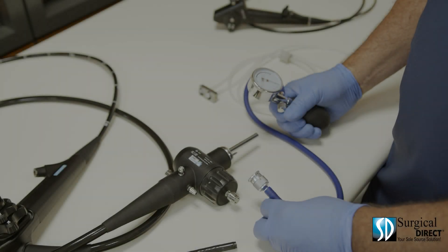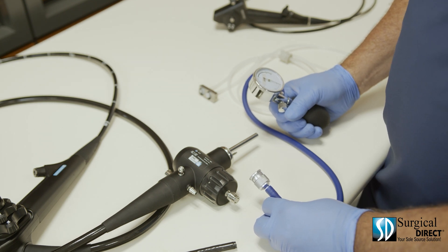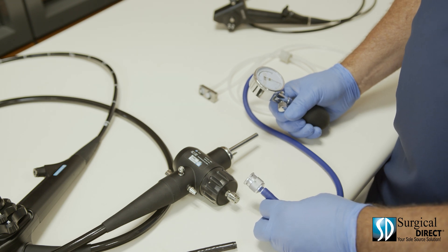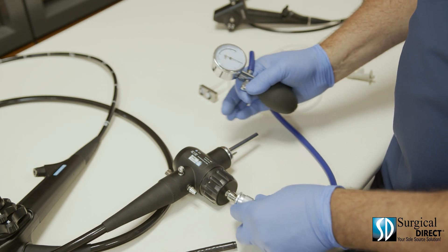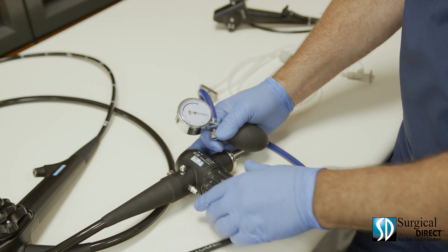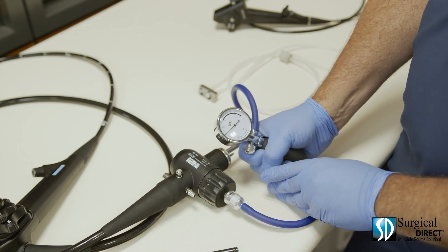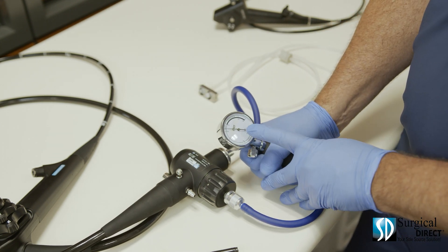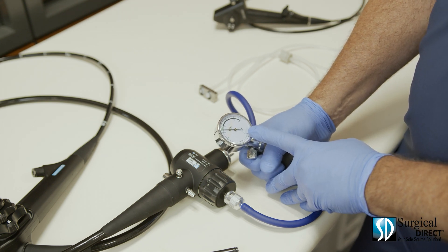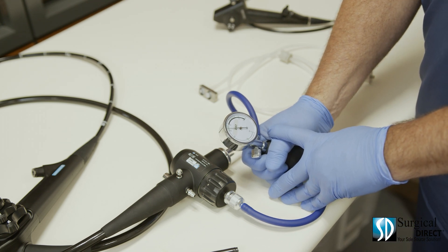The most important part of caring for your endoscope is leak testing. Catching a leak early is the difference between a complete rebuild on a scope and a small bending rubber repair. Attach the leak tester to the end of the soaking cap. Make sure it's locked on and the cap is tight. Using the hand pump, pump the scope up until the gauge is in the test area. Watch the gauge and make sure it doesn't drop. If it doesn't drop after a few seconds, you're ready to submerge the scope.